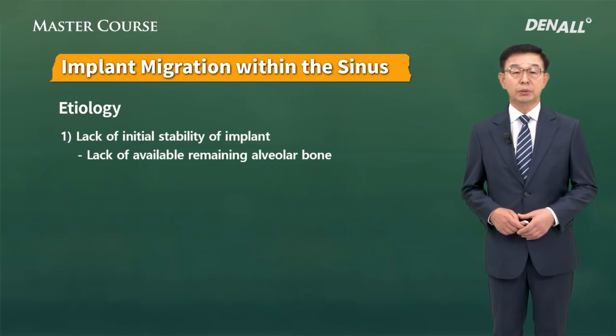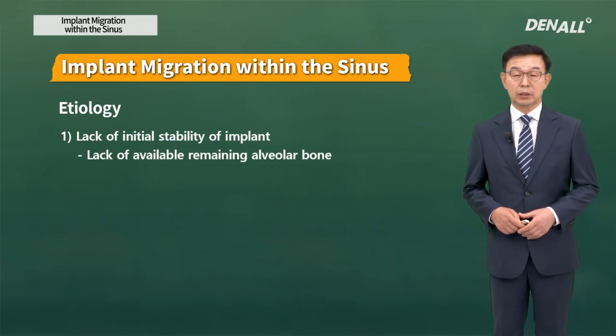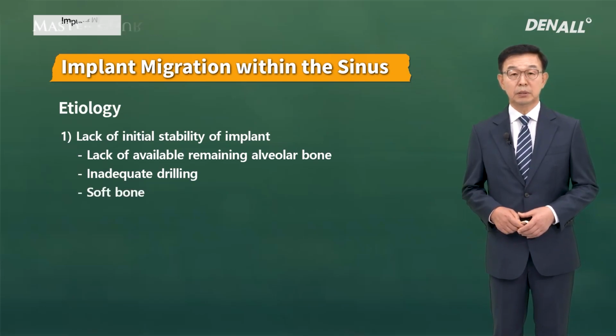When the implant is placed, the initial stability may not be good. In other words, drilling was not done properly or the bone was very soft. And as the implant was being placed, it migrated into the sinus.